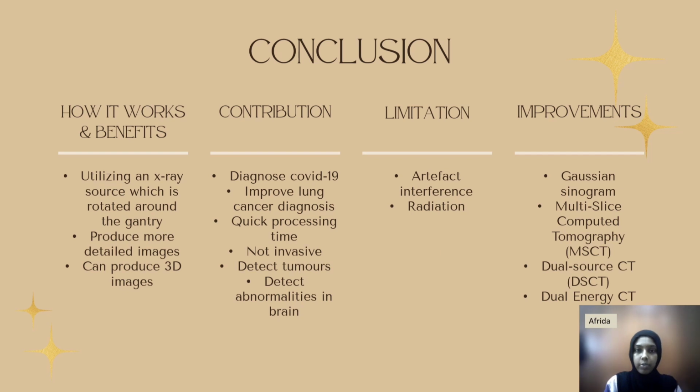CT scan is processed. And some have also proposed new techniques for using the CT scanners and also improvements that can be made to the software and the hardware of the CT scan. However, it should be noted that these advancements call for expensive machineries and also a high fee for the patients to pay. However, we can also be rest assured that with the technological advancements these days, who knows, the CT scanners could be improved to the highest quality possible in the future.